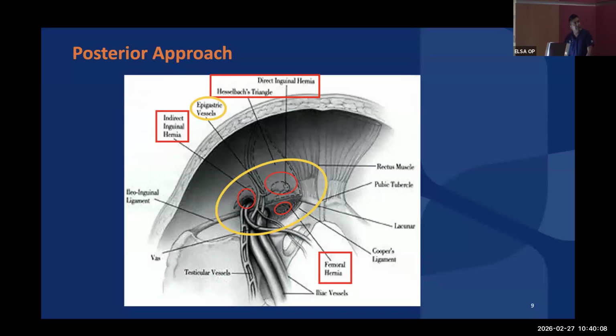So when you want to release the neck of a femoral hernia, it's important you protect the vessel, the iliac vein. So you can put your gloved finger in and then cut this fibrous sheet to release the sac. Some of these definitions may change in the future because we see hernias which behave more like direct hernias, appearing lateral to the inferior epigastric as well, but we still follow the EHS classification.